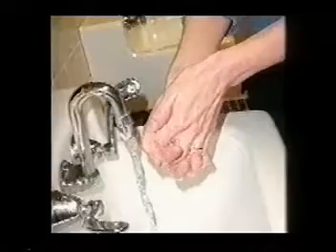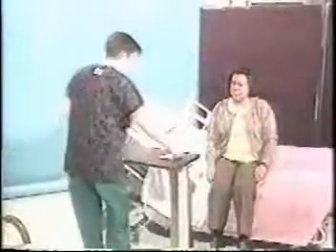Wash your hands. Gather needed equipment. Remove the sleeve if needed. Place the patient in a comfortable position with arms supported on the bed or table, palm up and at heart level.